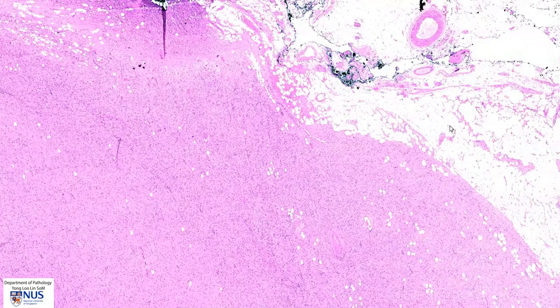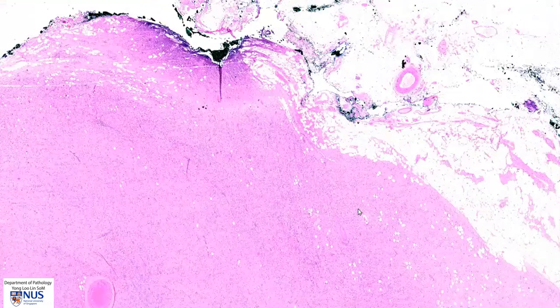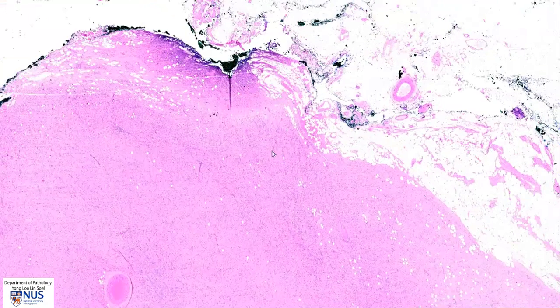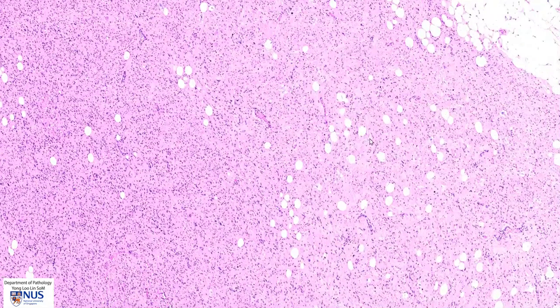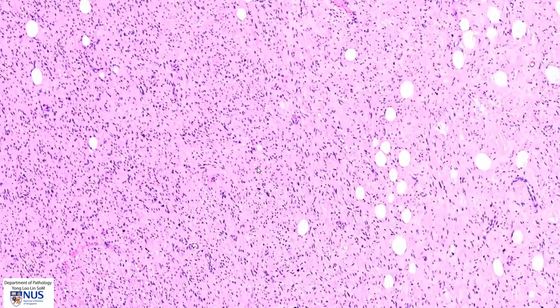This tumor, a ganglioneuroma, is arising in the fatty tissue just outside the adrenal gland. It is not encapsulated, although it is relatively well circumscribed. And we can see that there is some fatty tissue or adipose tissue in the tumor.